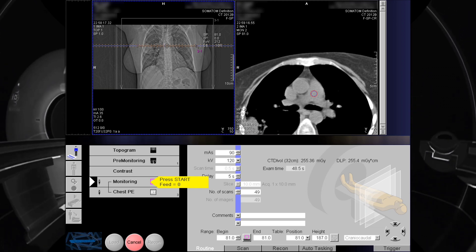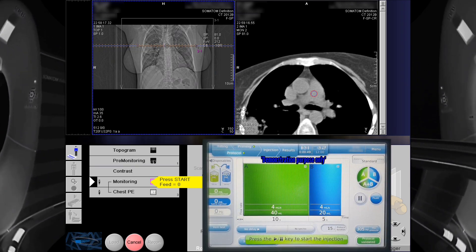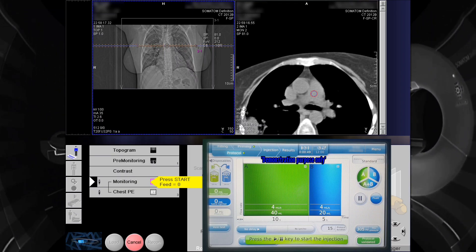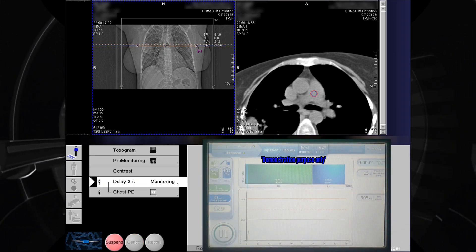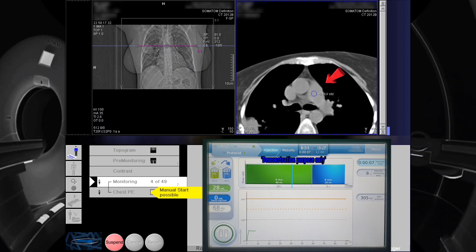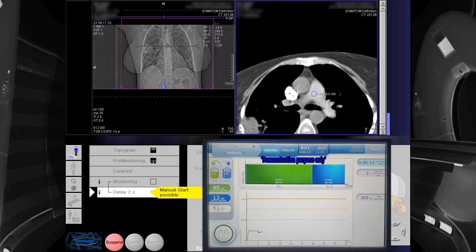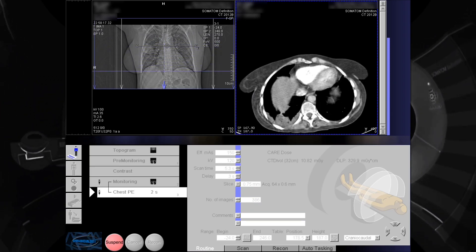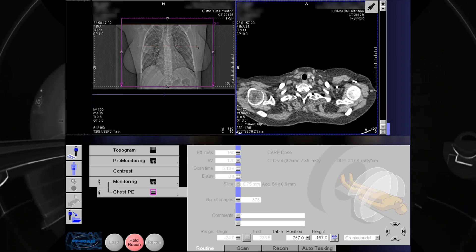Before starting, inform the patient that you are going to inject the contrast. Press the Scan button and injector at the same time. Once scanning has started, focus on the area of interest and monitor the filling of contrast. When the Hounsfield unit reaches 50 or above, press the Scan button again and instruct the patient to hold breath. After the scan, inform the patient to breathe normally.